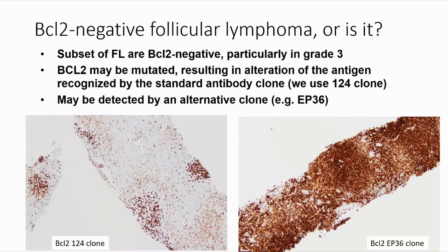Then you're asking, do I have an expanded population of B cells? Of course, you can also see a lot of T cells within a marginal zone lymphoma. You may see an expanded population of B cells with residual germinal centers, which you can see by Ki-67, and a lower Ki-67. It's both the morphologic pattern combined with the IHC pattern, and it can be quite useful to do kappa lambda. You don't always win, but if you get a light chain restricted plasma cell population associated with that atypical B cell population, then you can feel more confident.